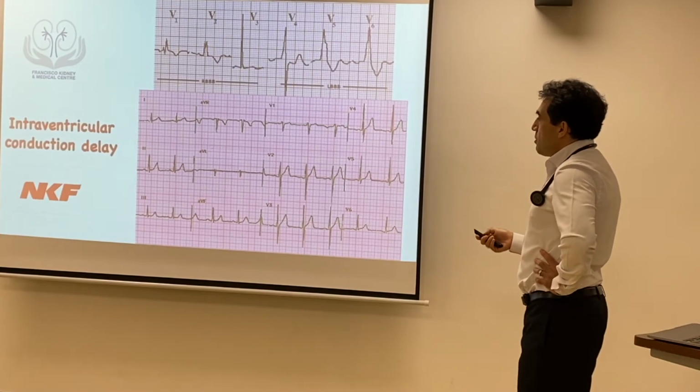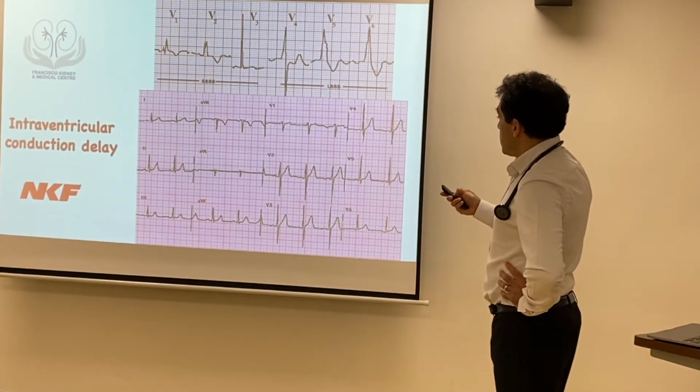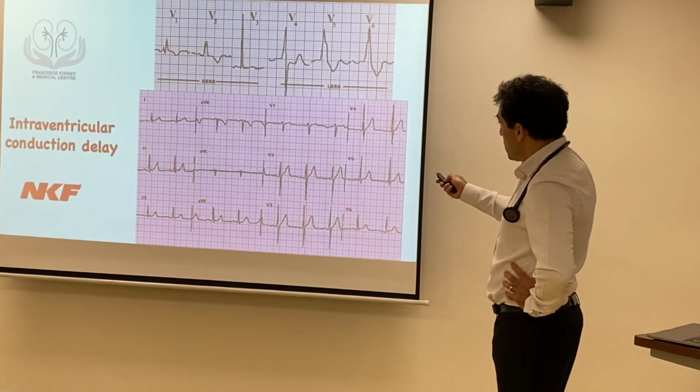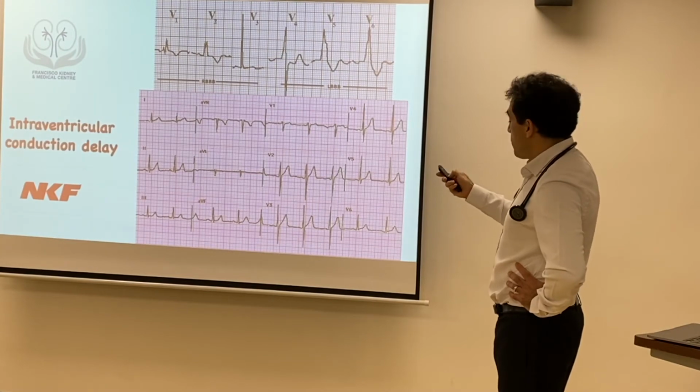We already talked about this intraventricular conduction delay or defects. We mentioned the right bundle branch block can also cause changes on the ST segment. As you can see here on left bundle branch block, also the ST can invert and look abnormal.